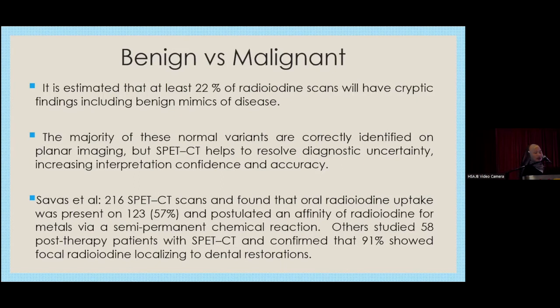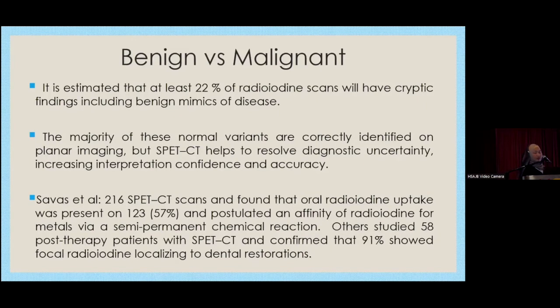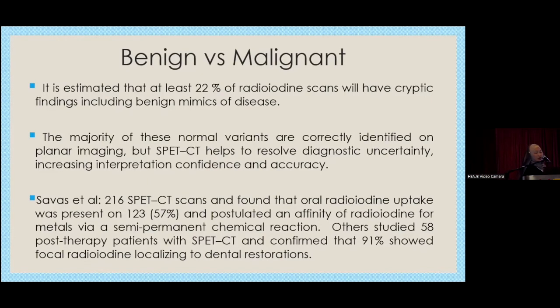Savas et al. studied 216 SPECT-CT scans and found that oral radioiodine uptake was present in 57%, and postulated that the radioiodine loves to go to these metal areas via a semi-permanent chemical reaction. Other studies have also shown that SPECT-CT confirmed that 91% showed focal radioiodine localizing to dental restoration.